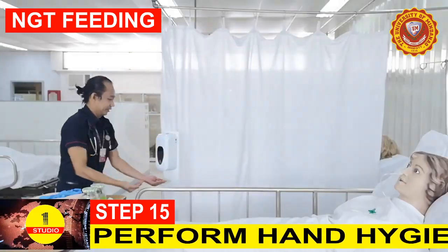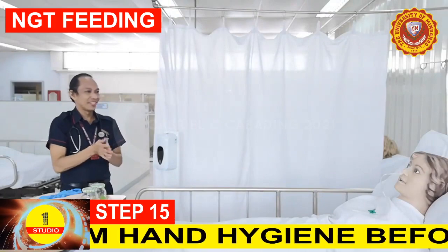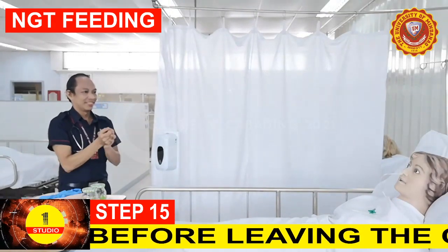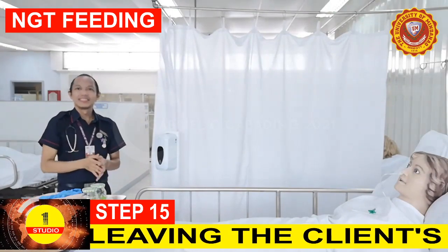Step 15. Perform hand hygiene before leaving the client's room. Use a 70% alcohol-based hand gel. Rub hands until dry.